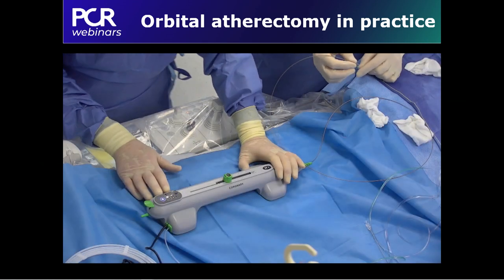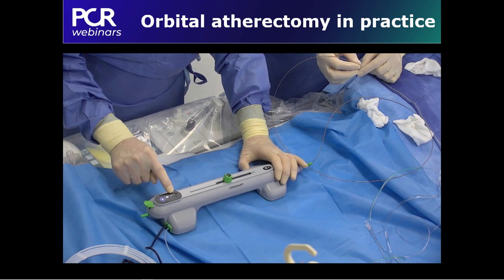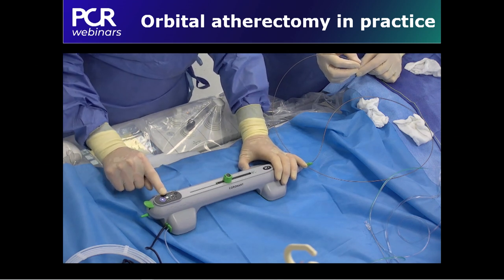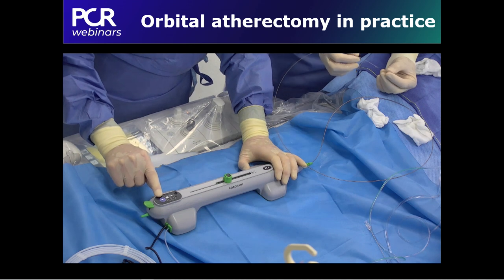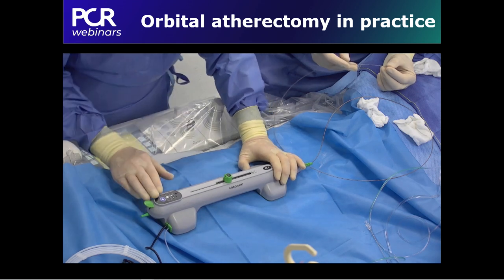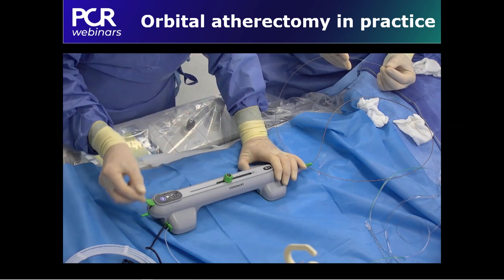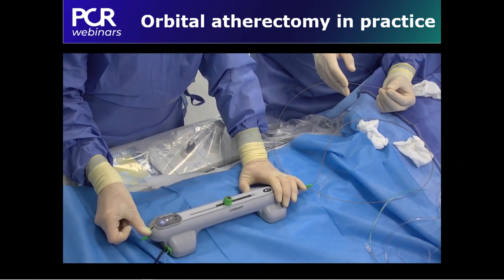On the distal part of the system, you have 2 buttons. The first one for the low speed of the system, 80,000 RPM, and the second one for the high speed, 120,000 RPM. And here you also have the button for the flush, the same one as on the pump. And a very important point is the wire brake. When we are going to rotate with orbital atherectomy, we brake the wire in this position.